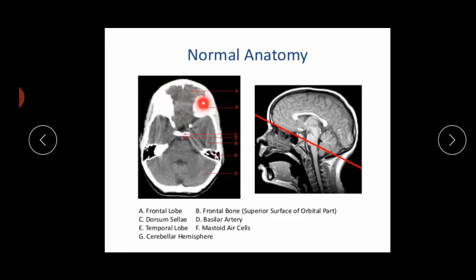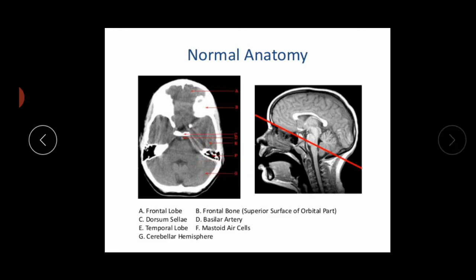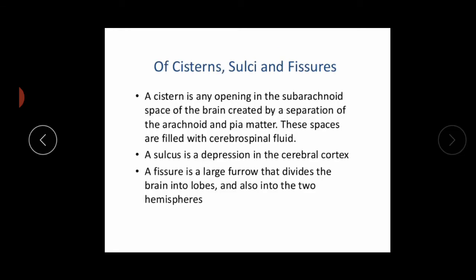On the next cut, we can see the frontal lobe and the frontal bone, which is hyperdense. Then the dorsum sellae, and the basilar artery is visible here. This is the temporal lobe. We can also see the mastoid air cells, the cerebral hemisphere, cisterns, sulci, and fissures.